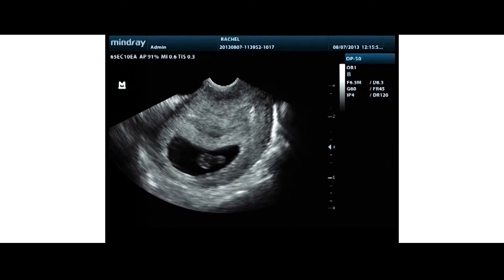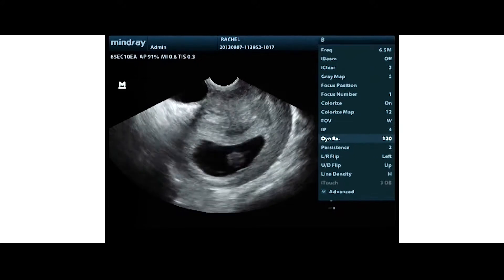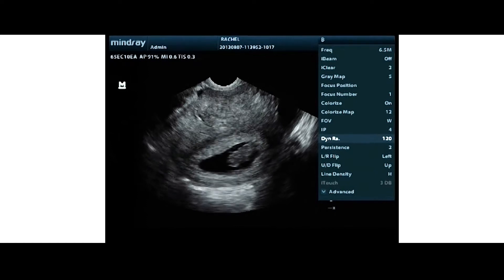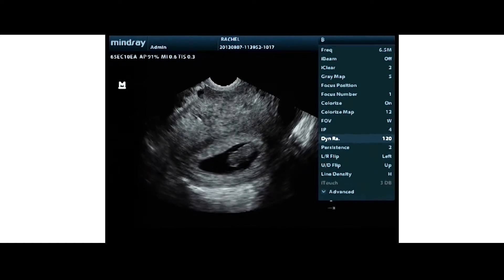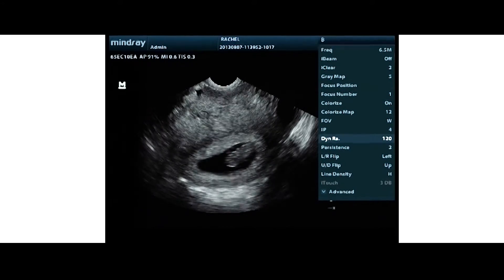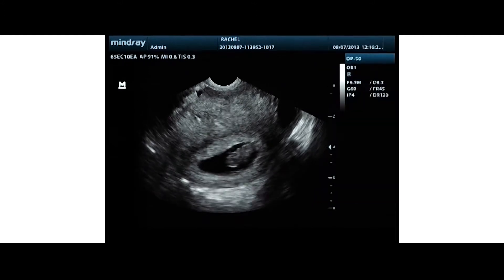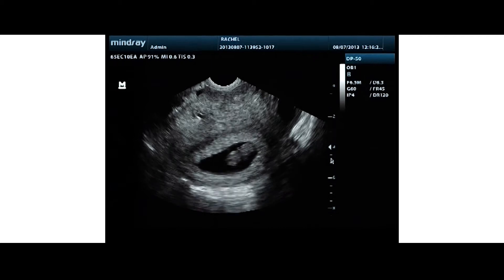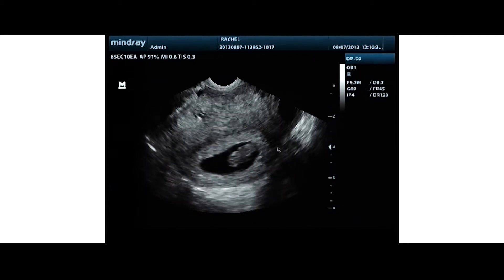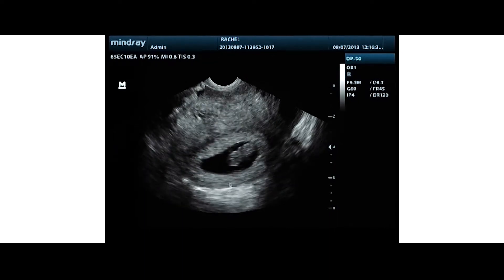What I would do here is go to my iZoom and bring everything right in — that's nice. You can still see the yolk sac and you get a nice crown-rump measurement ability there. To take this off, hit menu. So we have our focal zone right at the baby, and here's the beginning formation of the placenta, the gestational sac, and here's the baby.